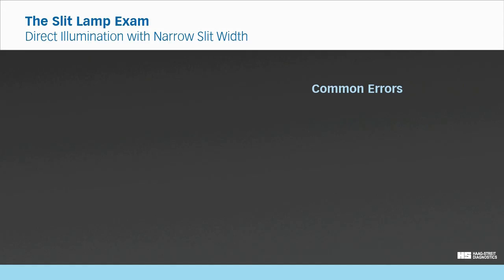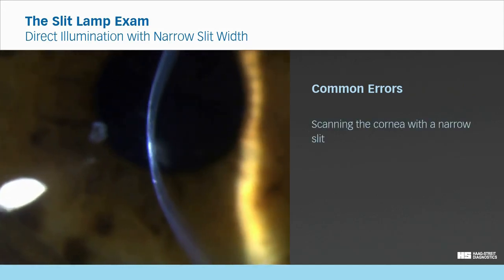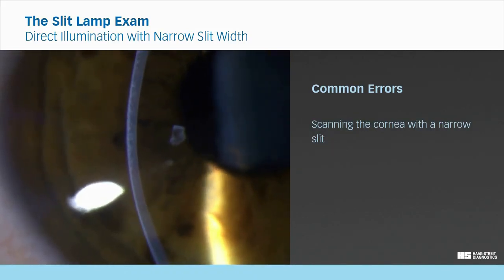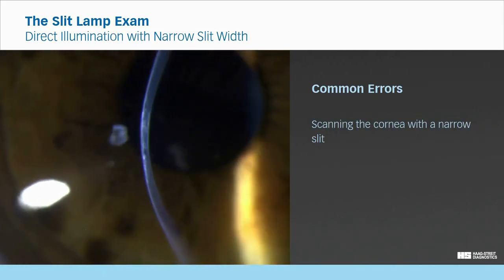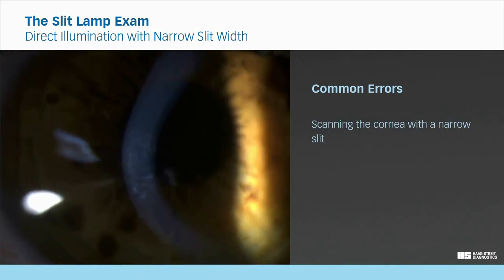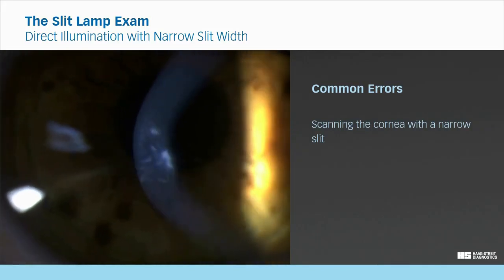Common errors. When scanning the cornea or the lens with a fine slit, there is a significant risk of missing small alterations in the tissue or on the surface. This is because the field of view is restricted to the intersection plane, which is very narrow. Therefore, always scan the cornea with a moderate slit and narrow the slit only when investigating the localization of findings.